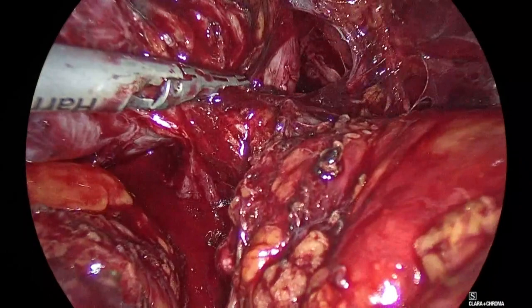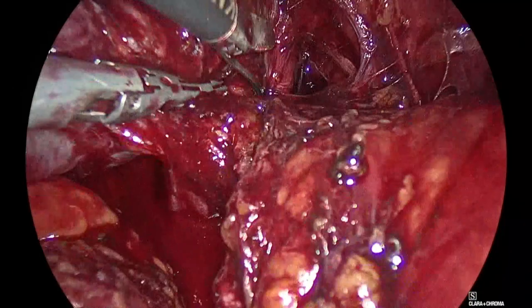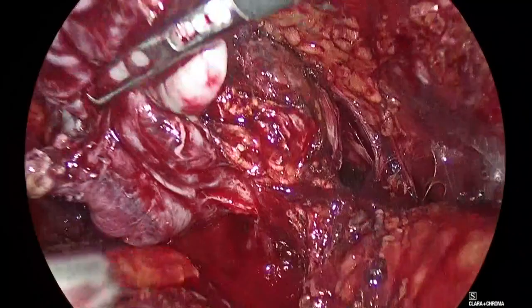Target plane is perfectly seen. Yep. So I will just make a small incision. Panagiotis is telling me that the positive cores are on the right side, so he's telling me to be careful on my cut here. I just make a superficial cut so this whole thing can go down very nicely afterwards. Good. Go back, Panagiotis. Good. Stay there. Good.